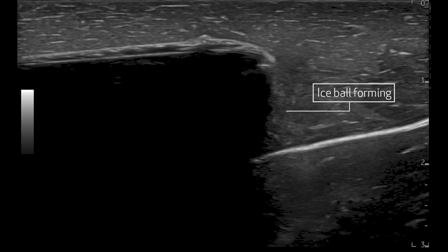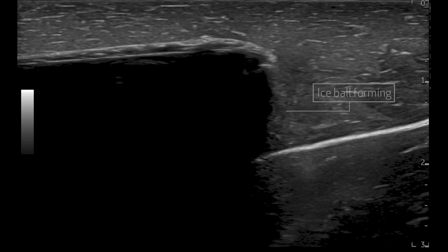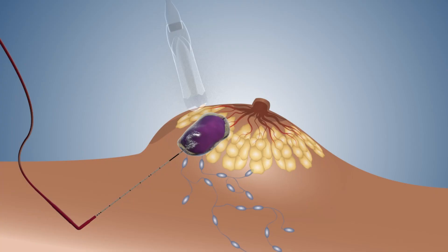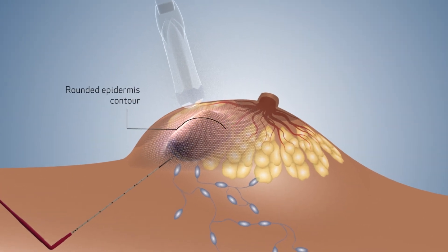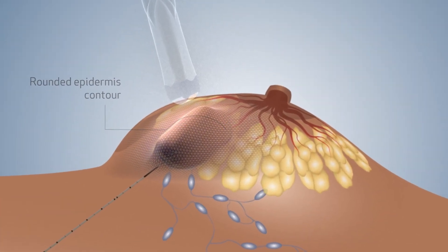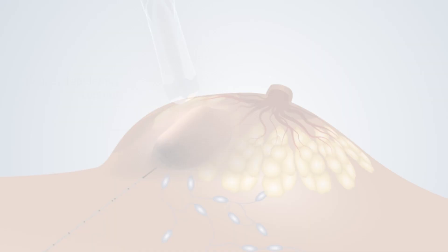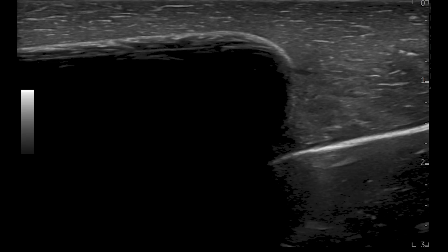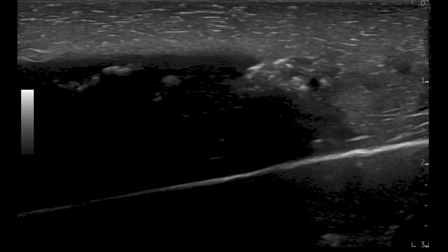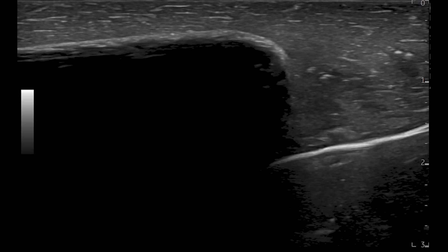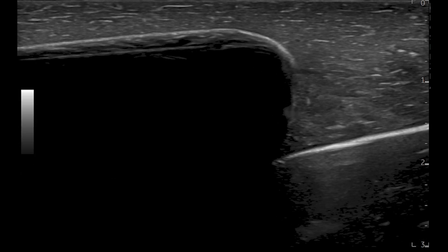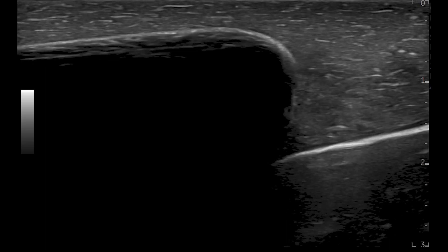Gradually, the definition of the needle becomes less visible as the ice ball continues to grow. The edge of the ice ball pushes into the adjacent tissue, resulting in a rounded contour. The physician scrolls through the visuals to provide a comprehensive view of the ice ball, represented by the black region. The ice ball is observed to exert pressure on the adjacent tissue.